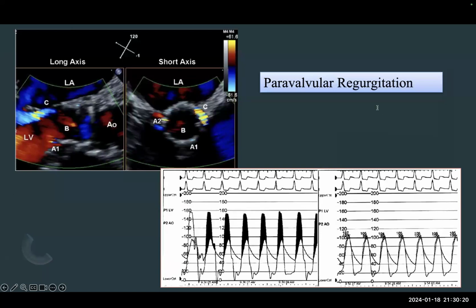For a patient at high risk of stroke, like bicuspid aortic valve, very calcified, where you need balloon dilatation and expect to do post balloon dilatation, those patients are more prone to embolization. Usually we just put the valve and leave. But in some patients with a heavily calcified valve, when we put the valve it may be under strain, so we need to dilate once, twice, three times. With each balloon dilatation, material is going out, and this can cause stroke.